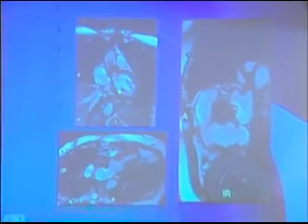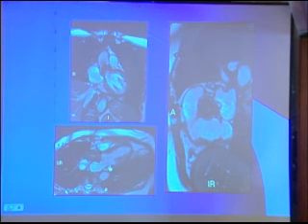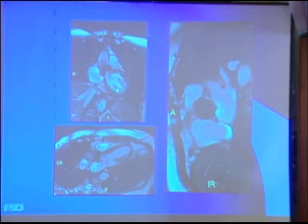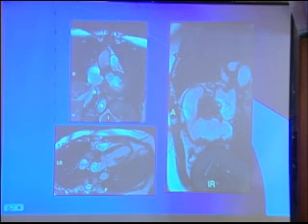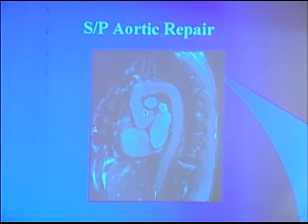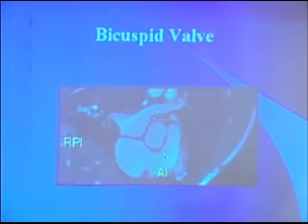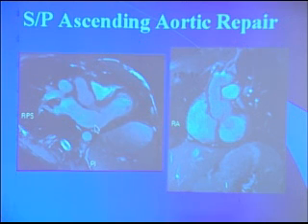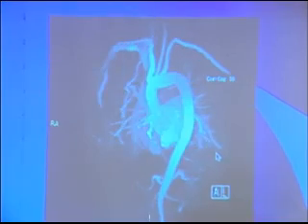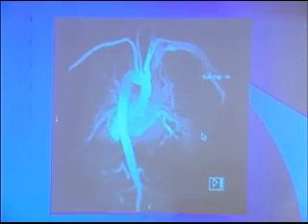Post repair: when you have a valve repair, you do have some artifact at the level of the valve itself. There is some type of flow that goes to and fro across the valve, but that's within normal limits. It does not prevent us from looking at the left ventricle or the mitral valve. This is the short axis view of the ascending aorta. In another case of ascending aortic repair, the native valve is still in place. You see a tube graft extending at the ascending aorta just above the level of the sinuses, proximal to the aortic arch. This is the native bicuspid valve — it's still functioning well, so it was not touched. I do like to have an MR angiogram as a first study post-repair, just to make sure that all the anastomoses and everything else went well.